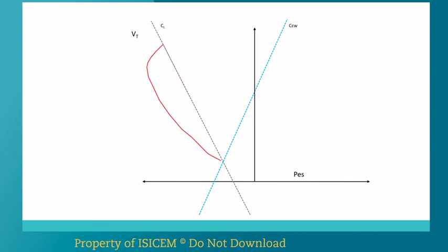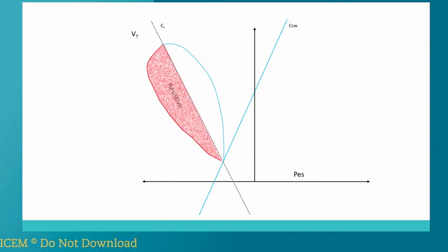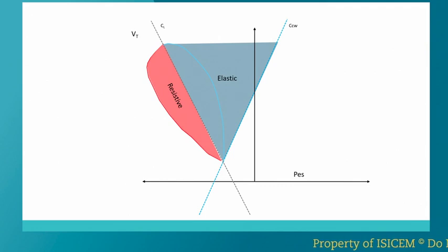You trace a PV loop, basically, which has inspiration and expiration, and with that you can actually separate the resistive component, the one that appears when there is an active breath, when pressure is being spent to overcome this resistive component to get volume into the lung. And then you can actually separate it from the elastic component, to give you an idea of how much pressure is spent to overcome each of these components.